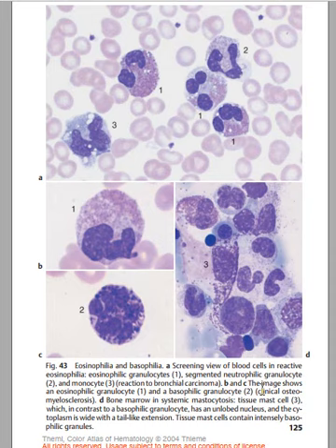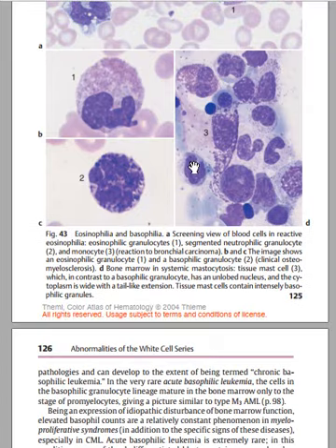The next one is diagram B and C. The images show eosinophilic granules in diagrams B and C. You can also see basophilic granules here in a multi-lobed nucleus. Now the next one is diagram D, bone marrow. In the bone marrow here is a systemic mastocytosis. Is it clear? You have tissue mast cells. In mastocytosis, tissue mast cells are going to be increased. So it's also another cause why you can have basophilia. You have mastocytosis.